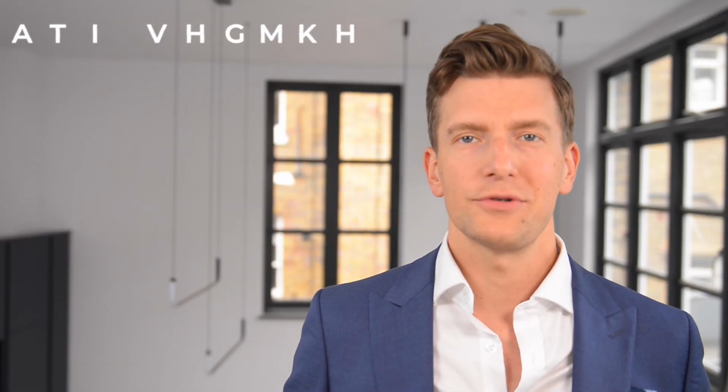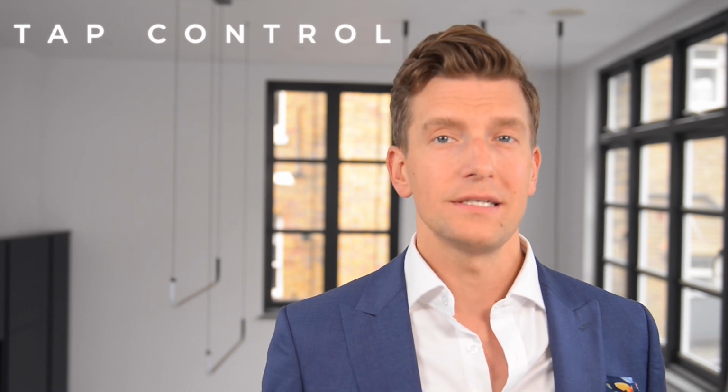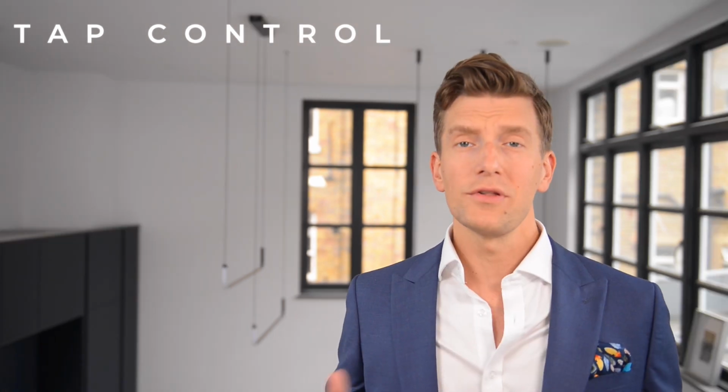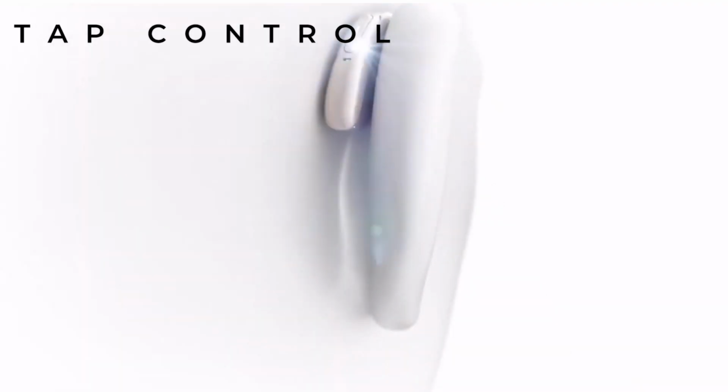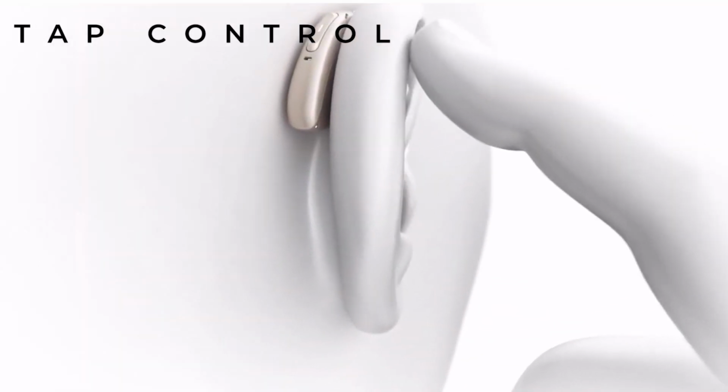Phonak have introduced a tap control feature in their P90s and P70 rechargeable versions, and what this allows you to do is to access both your voice assist or start or end calls or music or media just by tapping your ear a couple of times.